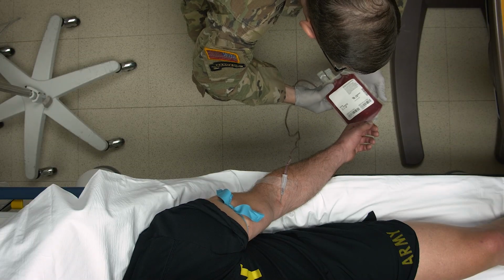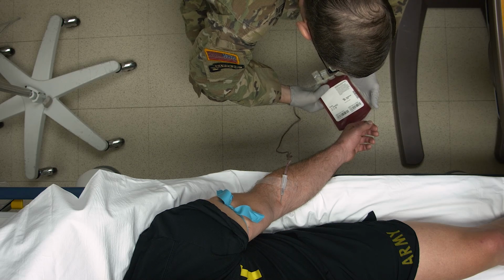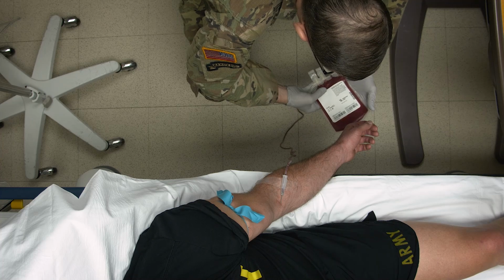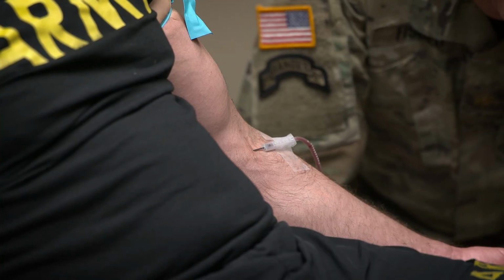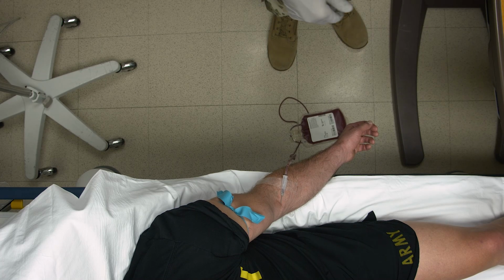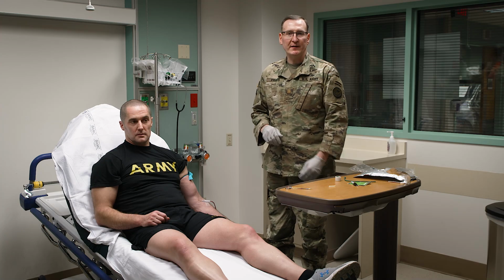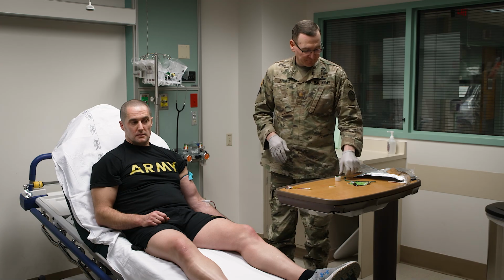This bag has citrate in it, which prevents clotting. So what I want to make sure is I get this citrate mixed throughout the blood as it collects into the bag. Now, I don't need to continuously rock it back and forth, but I do need to every now and then make sure that it is rocked appropriately to ensure mixing is done correctly. Usually it takes about 5 to 10 minutes to fill the bag up. And we can talk about the appropriate ways to measure for a full blood bag at this point.